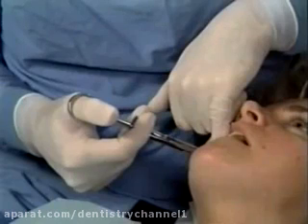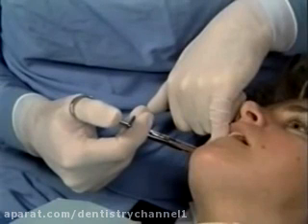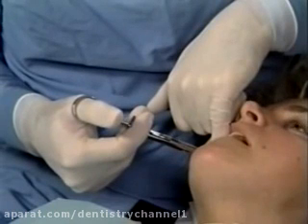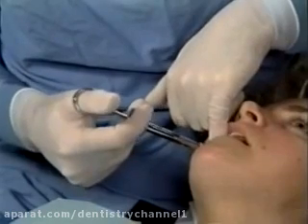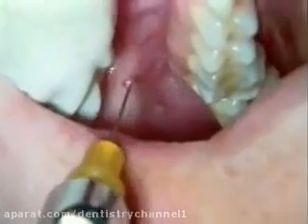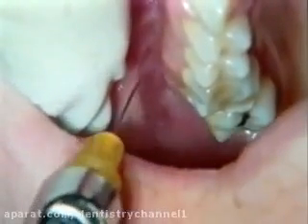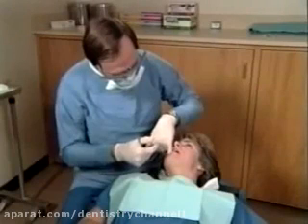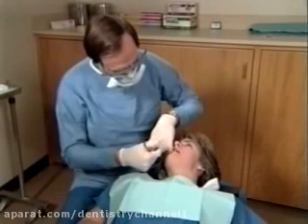With the proximity of the posterior superior alveolar artery and the pterygoid venous plexus, hematoma formation is a potential complication. This risk, quite low with proper technique, is increased if the needle is inserted too far laterally, and especially if it is redirected while embedded in tissue. Both errors tend to occur when the operator allows the cheek to torque the syringe medially during injection.